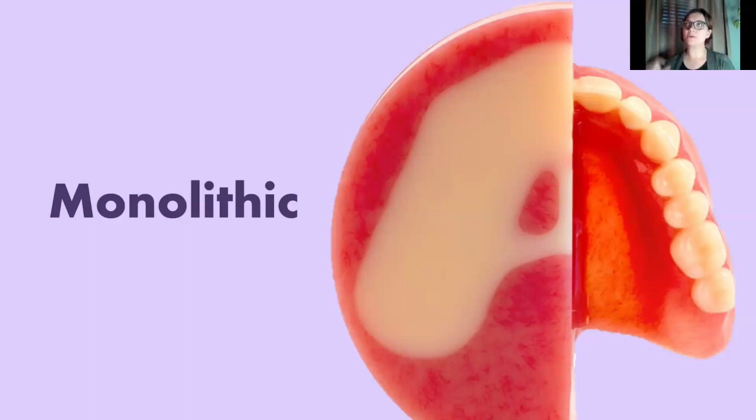And so when you think about the clearance that you need for a denture, you usually have to have 2 to 4 millimeters for the denture base resin and 2 to 4 millimeters for the denture tooth resin. So the minimum denture space requirement is going to be about 6 to 8 millimeters. And with a denture that is monolithic, now you can condense that down even more. So if you have a limited space patient or a patient that keeps debonding denture teeth, this is a fantastic solution because you don't have to worry about those pop-offs of the denture teeth.